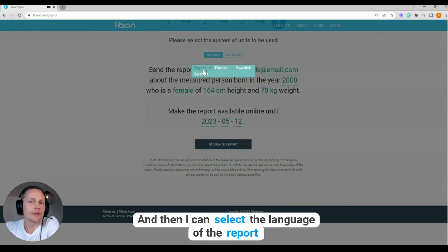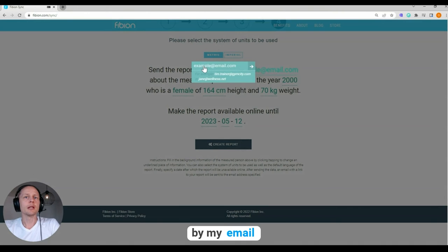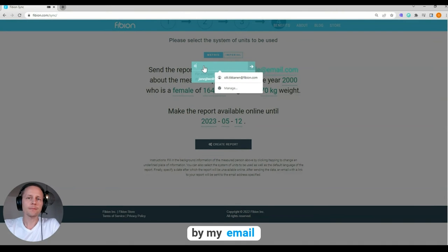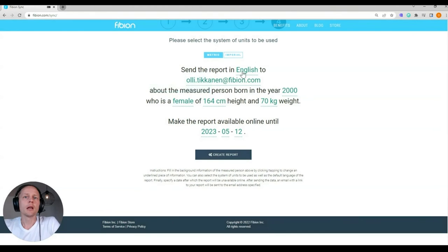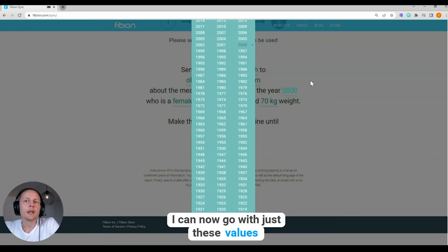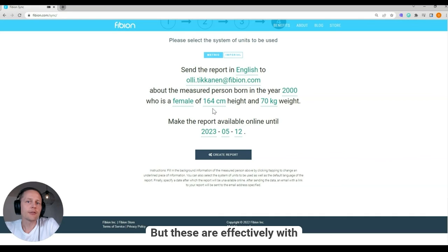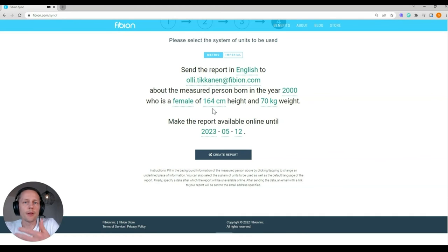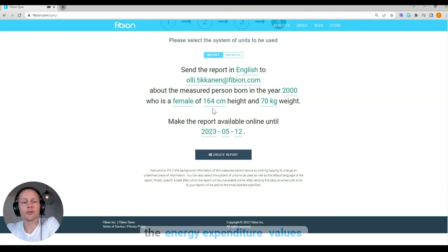Then I can select the language of the report and I can put in my email. The birth year can be entered here as well — these values affect the energy expenditure calculations.